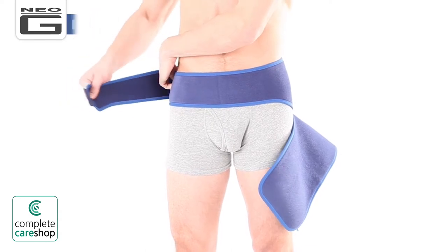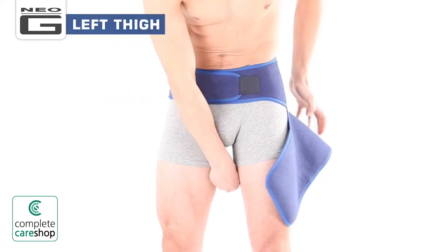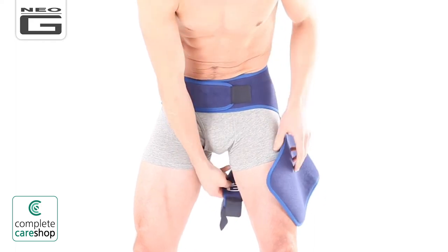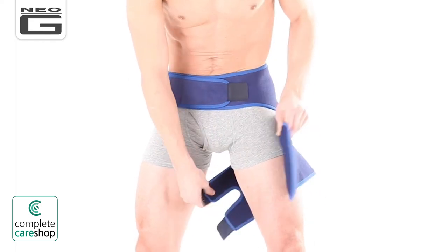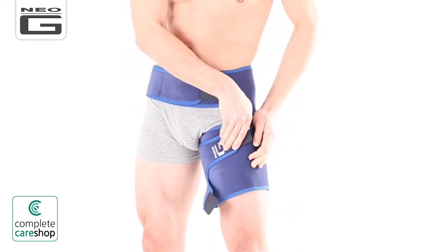With the Neo-G logo facing outwards and all the fasteners undone, place the support across either the left or right side of your body. Bring the long belt-like straps around your hips and lower back, and fasten them until firm yet comfortable.